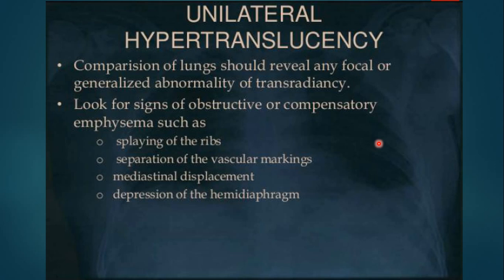Is there any mediastinal displacement away from the hypertransradiant hemithorax? Because the lung is hyperinflated, it will displace the mediastinum to the opposite side. And is there any depression of the hemidiaphragm? Because the lung is again hyperinflated, it will cause inferior depression of the hemidiaphragm.